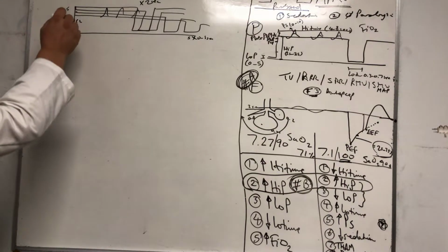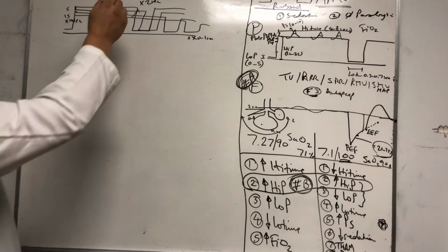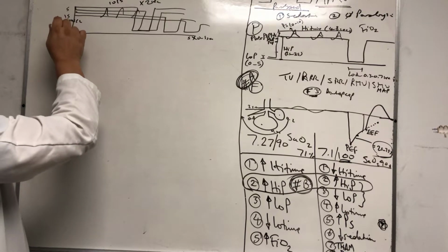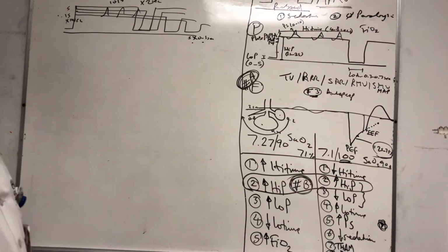So if this example stands here, what's the equivalent settings on SBT? And I added pressure support of 10, for example. So you have 15 pressure for 14 seconds, 5 of pressure for 0.5 seconds, and we added pressure support of 10 to support the patient. What is the equivalent settings on pressure support for this? That's 5 for 0.5 seconds, yeah.